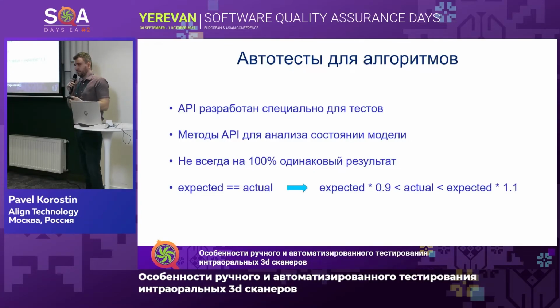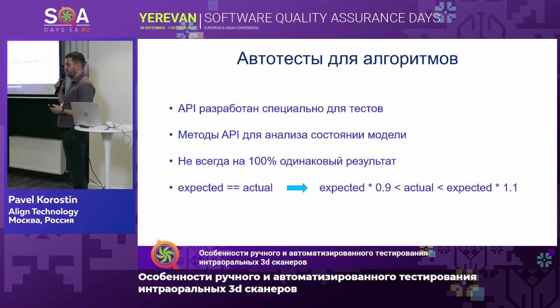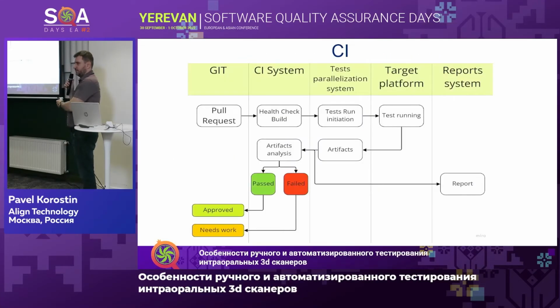For instance, for the algorithm which detects roughness or imperfections locally, you use a special matrix to validate it. Here we have yet another interesting thing which shows that algorithms do not always show similar 100% results. Maybe visually it is not detectable, but in numbers the difference can be some increments of percents. So that's why we have removed strict asserts. Instead, we have some deviation tolerances.